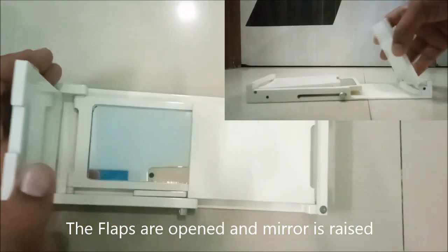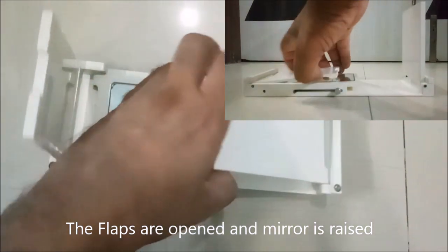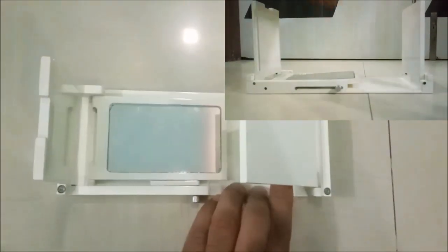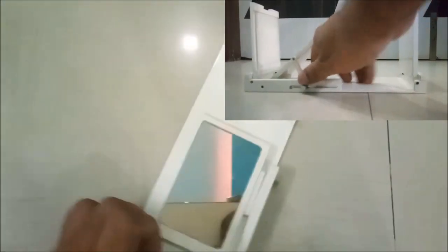As you can see in this video, I am raising the two side flaps of the kairoscope which are collapsible. Next, the mirror is raised and put in place. Now it is ready for the upper lid to be put in place.